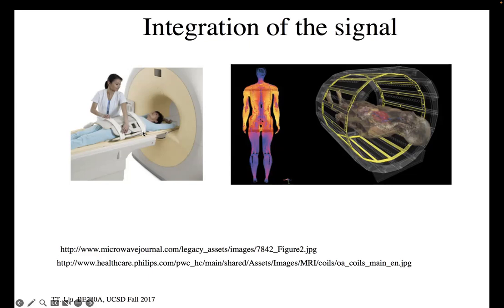This coil also is designed to measure very small signals, and it has very strong preamplifiers locally right at the coil elements themselves. You could have a coil like this that also transmits, but the transmission would have intensity changes across the patient, and it would be quite inconvenient. So usually you transmit with this more uniform coil.